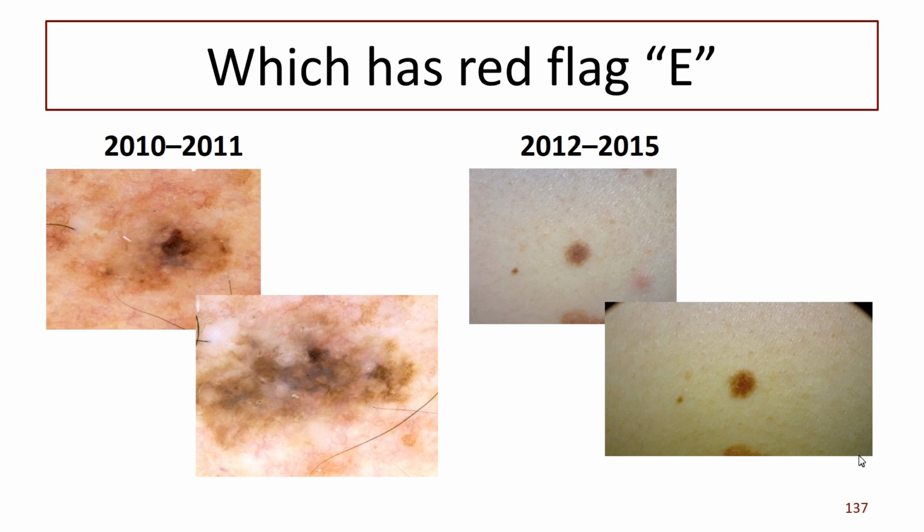No other ideas? Incompetence as a dermatologist? Might have been Peter. Did you diagnose this one, Peter, and miss it? Which one? This one. That's 2011. I don't know. Any of us could. We're always missing them. Peter, give me some examples why we miss melanomas. Yeah, we miss them all the time.